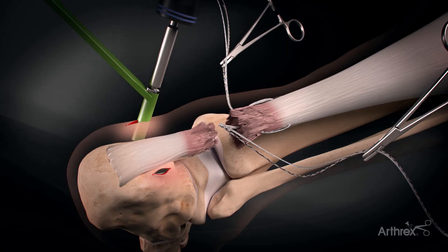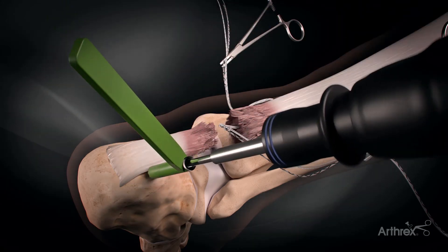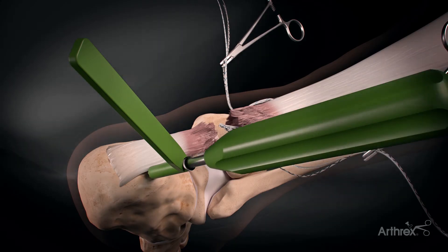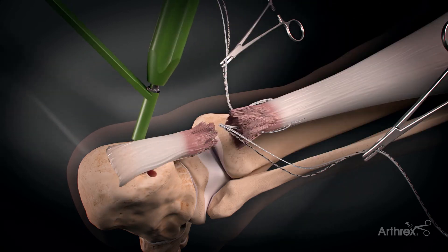We drill and we tap, and this is to anchor our mid-substance repair kit. As we know, the common area where this fails is in the knot, so this bypasses that failure point.